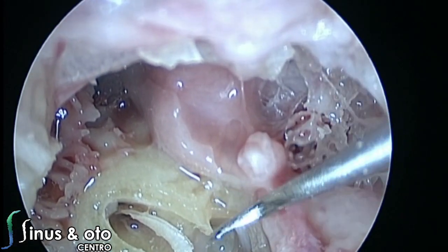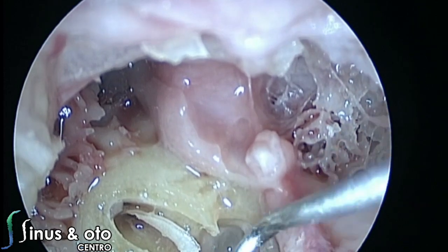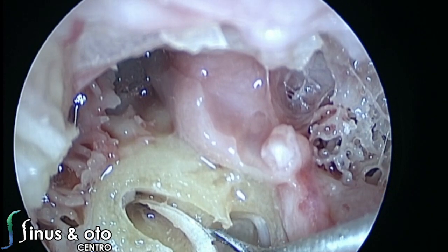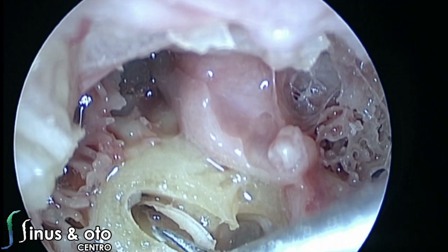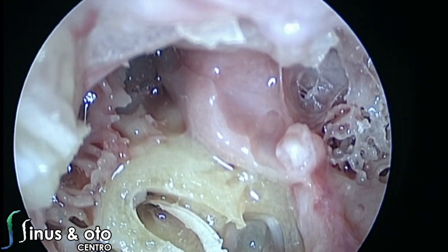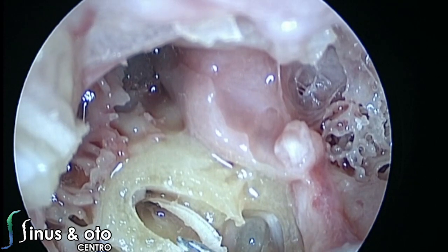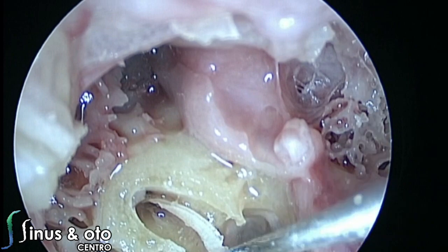This dissection is going to take us to the inner ear and also to some structures that are beyond the middle ear. We already did the endoscopic middle ear dissection with the structures ponticulus, subiculum, and funiculus. Now we are going to open the cochlea and the structures nearby. First, we completely remove the ossicular chain, we remove the stapes, and then we open the vestibule.